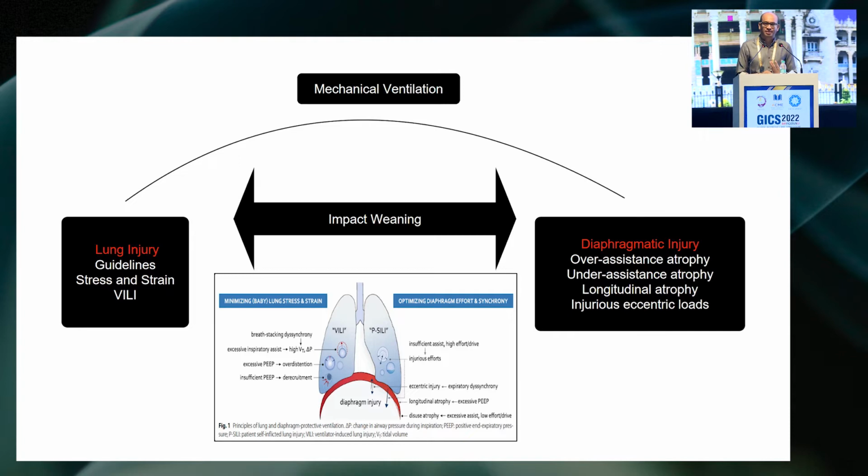you ventilate. The way we ventilate our patients has a tremendous impact on whether the patient can be weaned or not. Both with respect to your ventilatory strategies which impact your lung injury, and at the same time your ventilatory strategies which also have an impact on the diaphragmatic function.